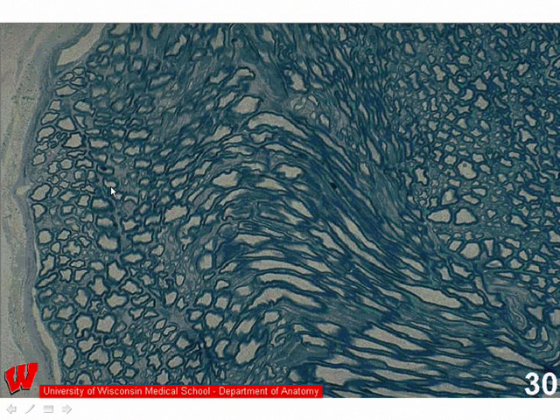And the clear area in the middle is the cytoplasm of the axon, which is filled with neurofilaments and microtubules. You can't see that at this magnification, and don't worry about that, but we'll look at things a little bit later where you will be able to see those structures.